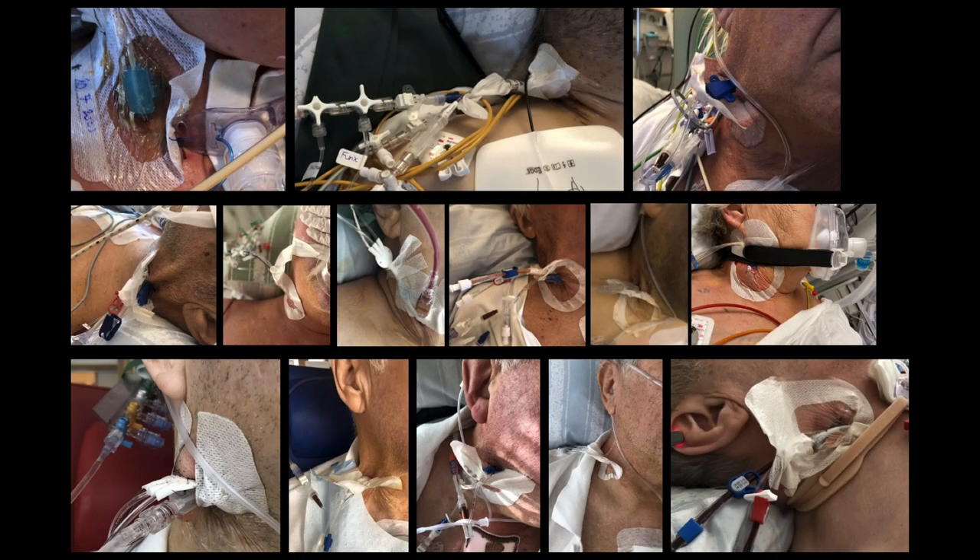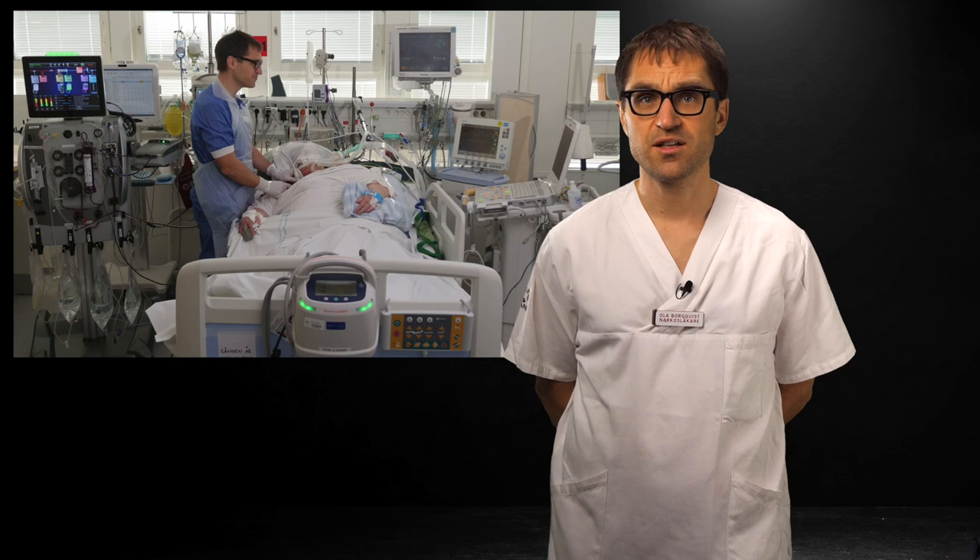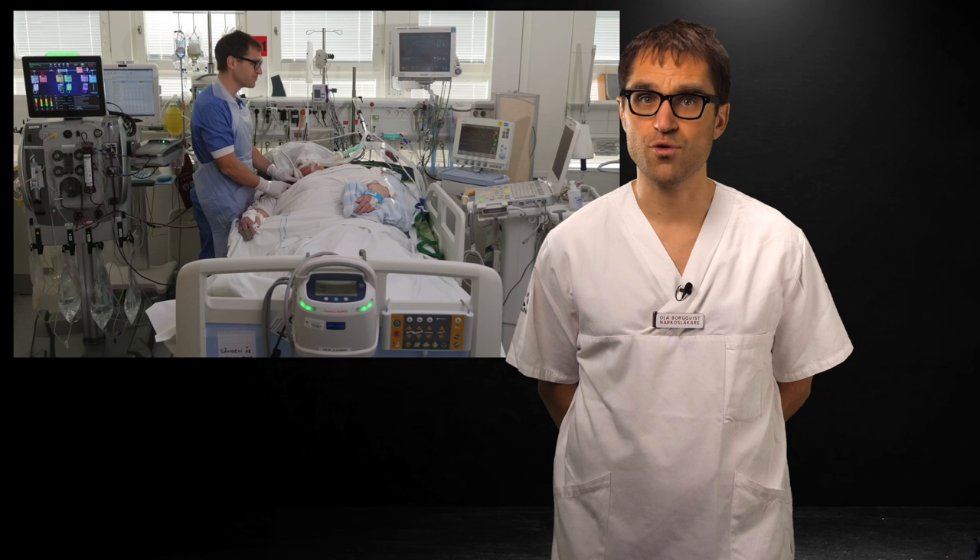Here are some examples of patients who have passed through our ICU with IJ lines where we would have preferred a subclavian approach. Compare it to the subclavian line. A subclavian also improves physician comfort — it is much better to stand by the side of the bed rather than wrangling ourselves past infusion pumps and ventilators towards the head of the bed. And finally, you need to practice subclavian line placement regularly, otherwise you will be unable to perform it when you really need it.